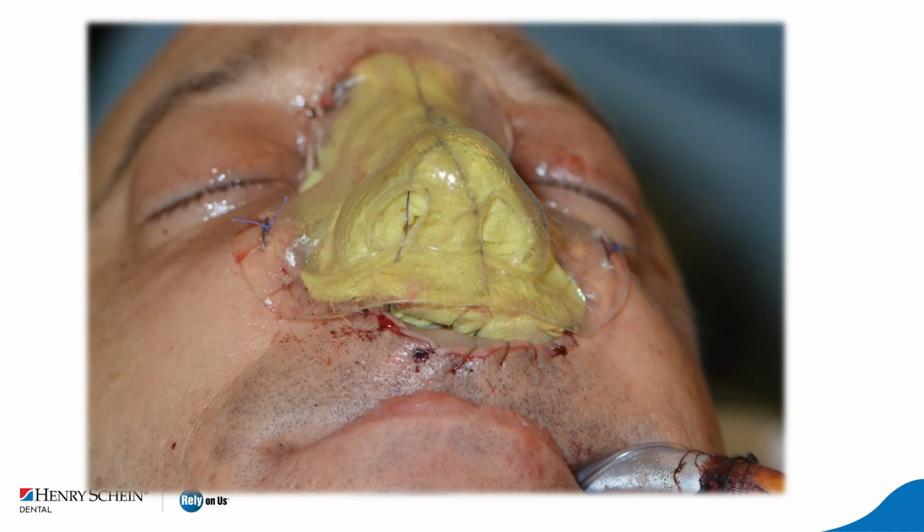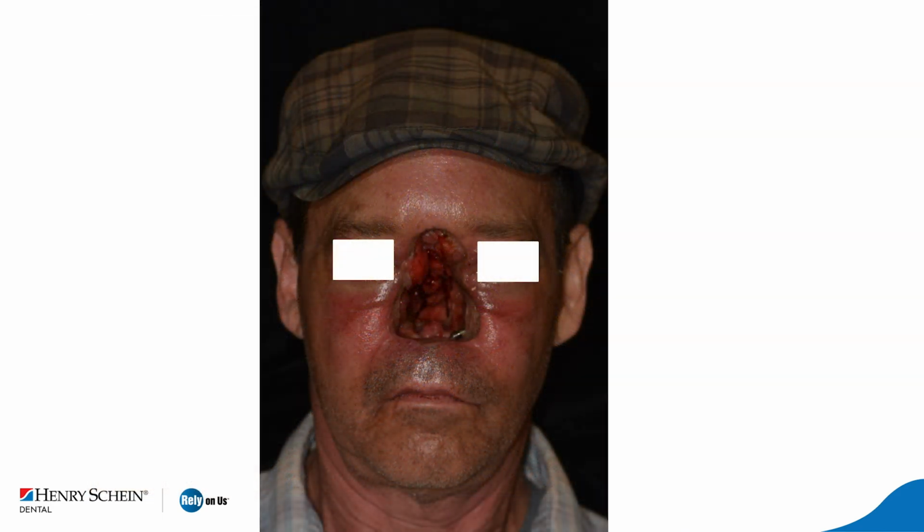So that is the patient post-op with the oral and maxillofacial prosthesis and the packing. And that is the after, 2 weeks after the surgery. So those are not the before and after you want to have in your practices. So always keep in mind that head and neck cancers are part of the journey. So always be very aware and try to assess the whole volume, because unfortunately, that is something that can happen within your career. You can face one of those cases.